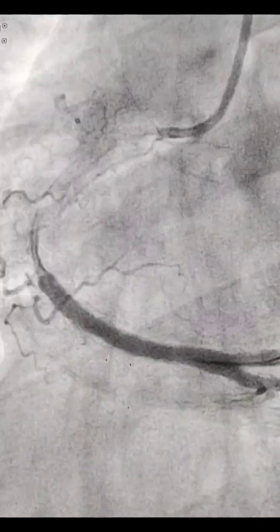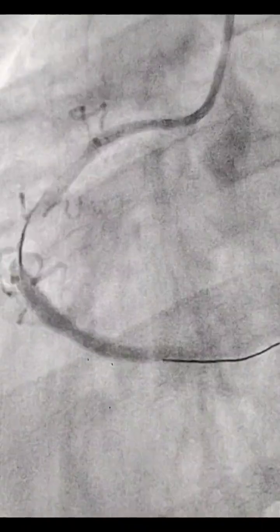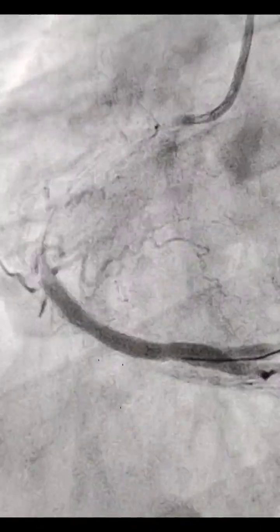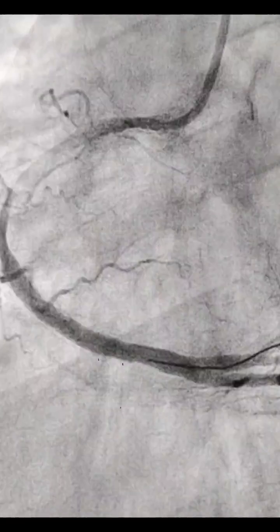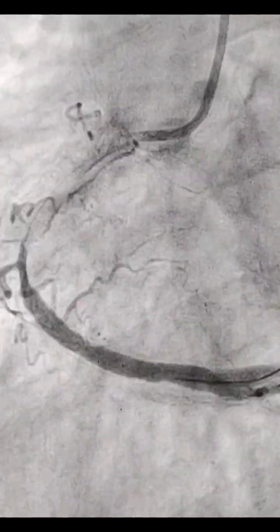So this was the thrombosuction catheter, and we did the thrombosuction in hope we'll get the clearance so that we'll call off the day, but there was a very long way to go. And even after thrombosuction, you can see the contrast, it got worse, then gets better. So this was the picture.